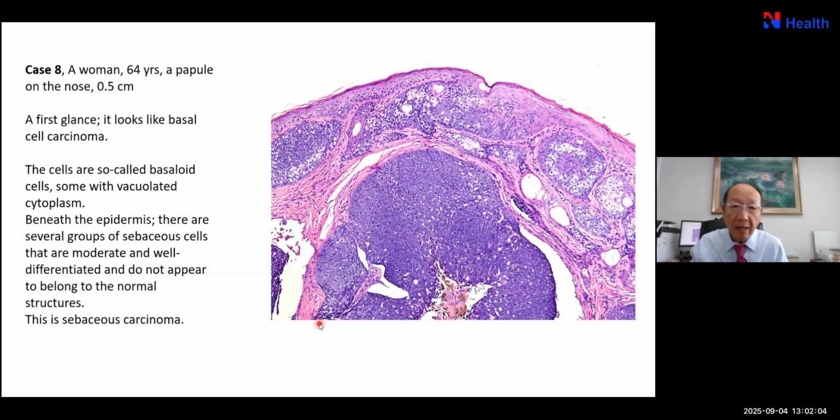But there's another component between the large masses. There's a smaller lobular mass lesion, lighter color, and with some of the sebaceous cells. This part and its smaller component is part of the tumor, the same thing. They are not part of normal structure.